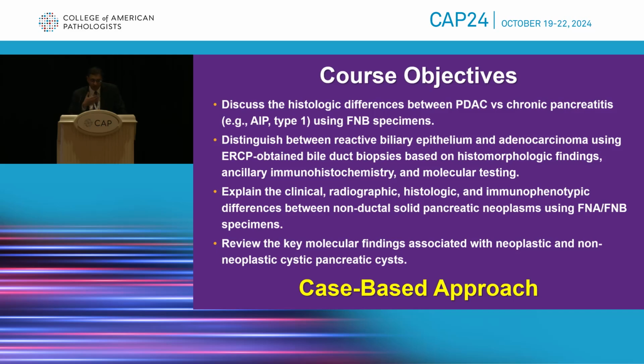Now, in the short time we have together, Chris and I debated how to go through the material in the course objectives, which obviously is a lot. And as we agreed, it would be best to present the course as a case-based approach of 8 interesting cases that we actually encounter pretty frequently. And in so doing, we decided to focus on providing a systematic or maybe an algorithmic approach to evaluating pancreatobiliary lesions by subdividing them into solid and cystic lesions.